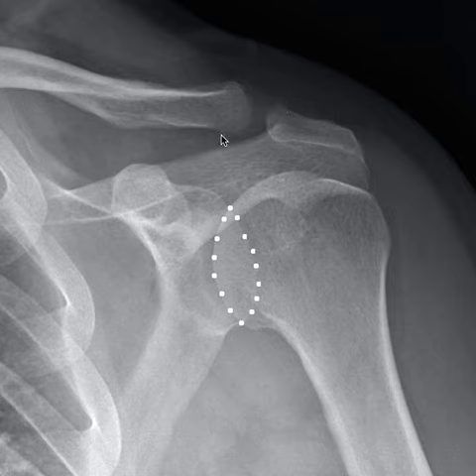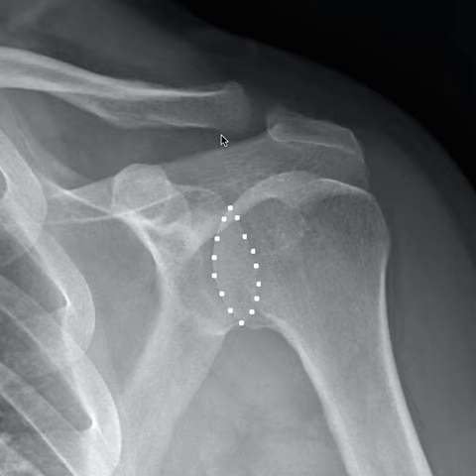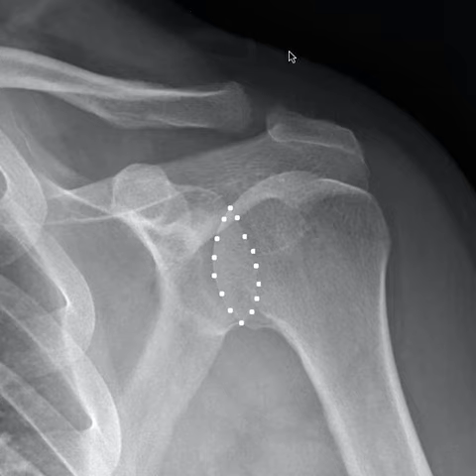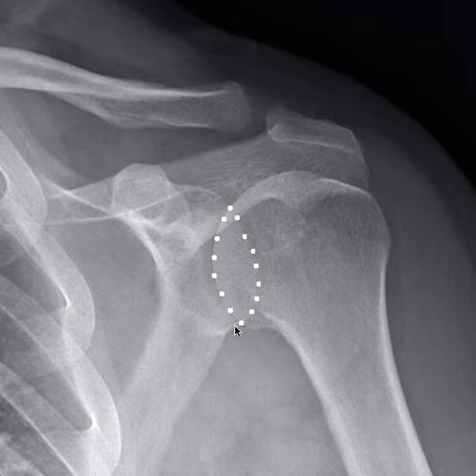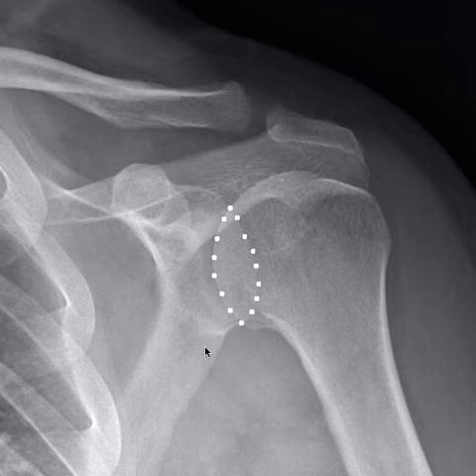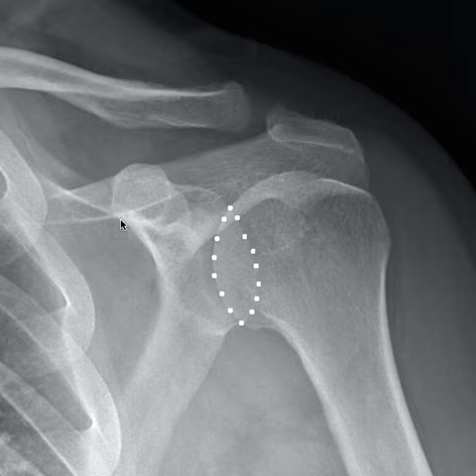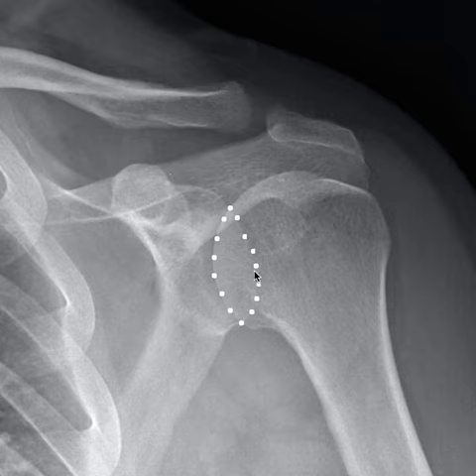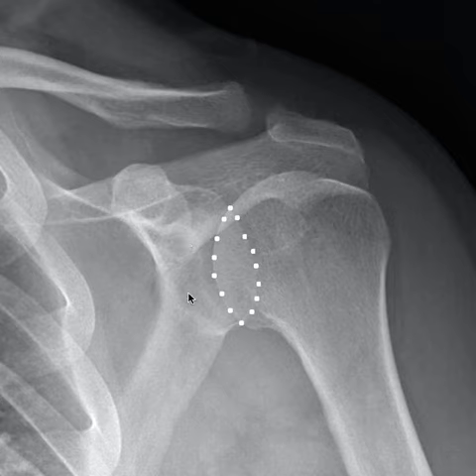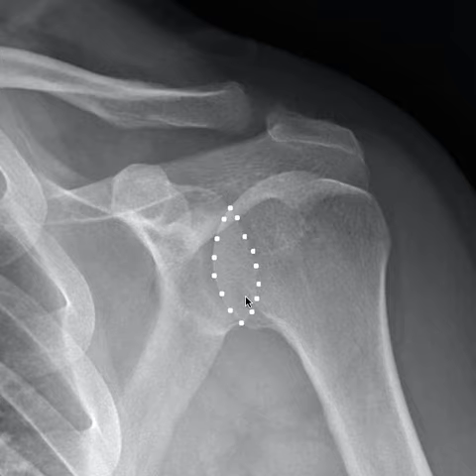If there is a separation — and we often get called for AC separations — you can just put it in a sling and have the patient follow up as an outpatient. The only exception is when it's threatening the skin and at risk of becoming an open fracture. This is the acromion, the most lateral projection of the scapula, which is the shoulder blade. You can see the scapula here. The x-ray doesn't really show the most inferior portion of it. The things to notice on an AP view are the coracoid, which is its anterior projection — it is the site of the coracoclavicular ligaments. It appears as a circle because it projects forward. Then following it down, you get to the glenoid, which is really an oval surface.